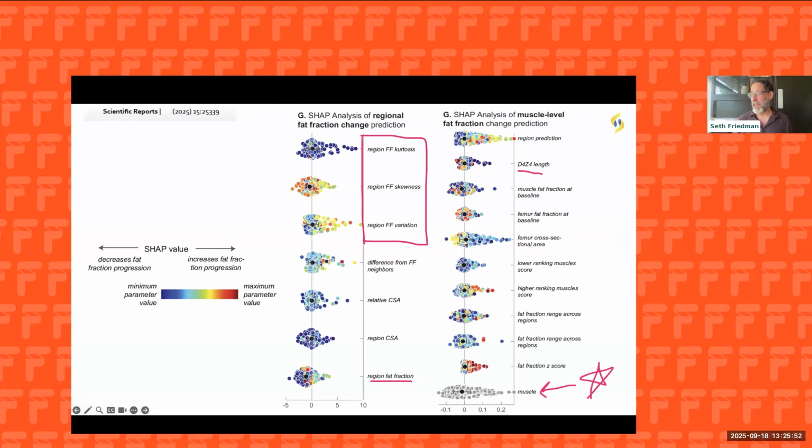It's a little different than how you think about normal correlation, where we're all used to seeing a correlation plot, which is a variable on the x-axis, a variable on the y, and a nice linear method. What we really get out here is terms out of the model that are significant. There's two things I want to highlight. In the middle frame here, this is called a SHAP value, S-H-A-P.